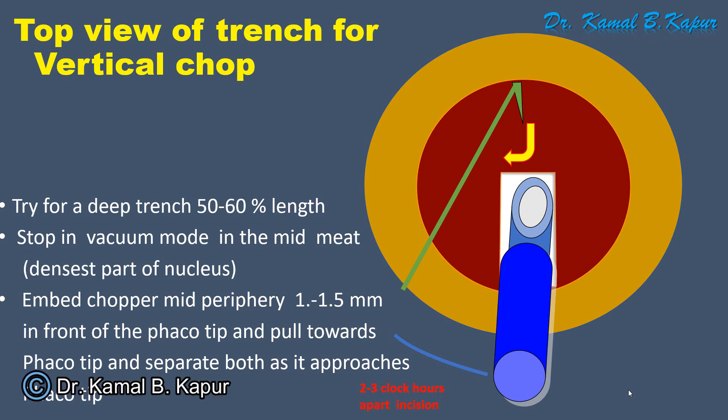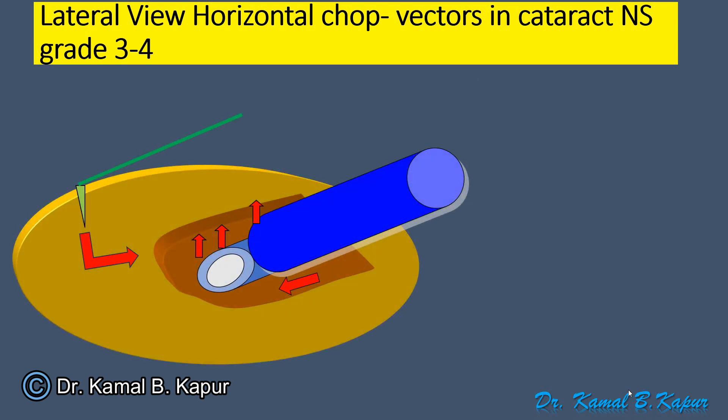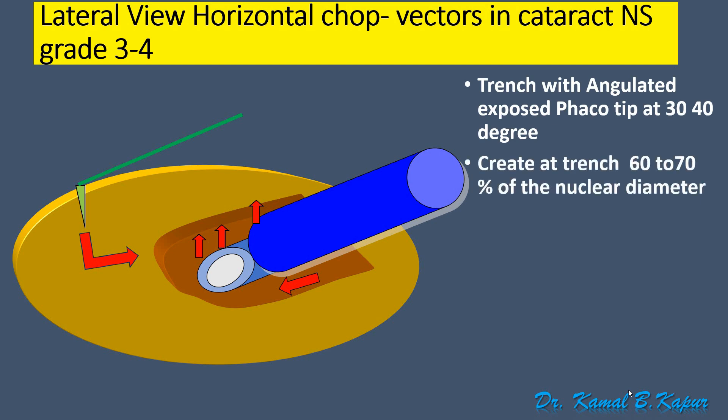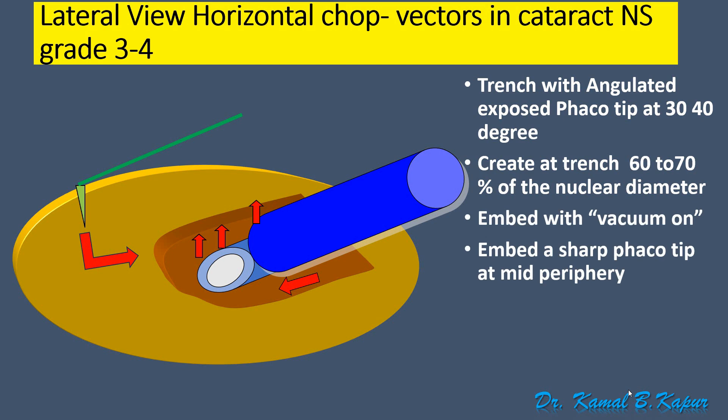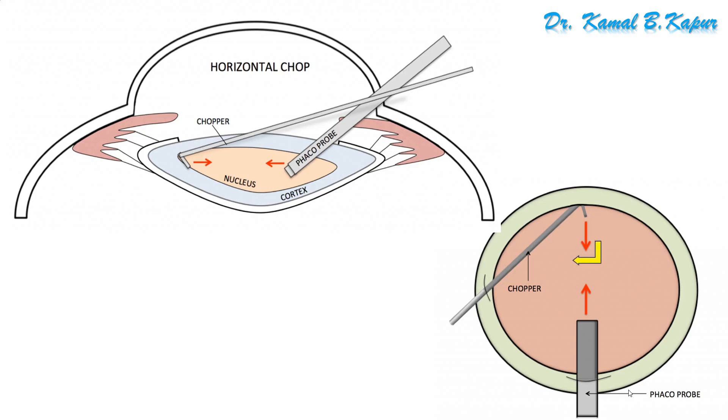This movement has three vectors. First, embedding inside the nucleus at the mid-periphery. Second, pulling towards the FACO tip while the FACO vacuum mode is on. Third, as the chopper approaches the FACO tip, a sliding sideward movement of both instruments creates a clear chop. Unlike a vertical chop which has only two vectors — embedding and separation — the horizontal chop adds the pull component.